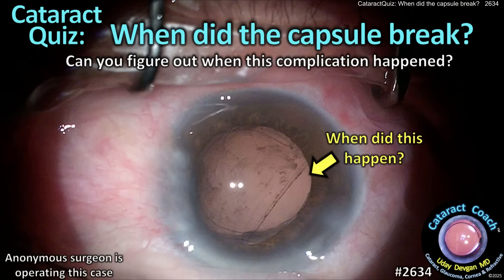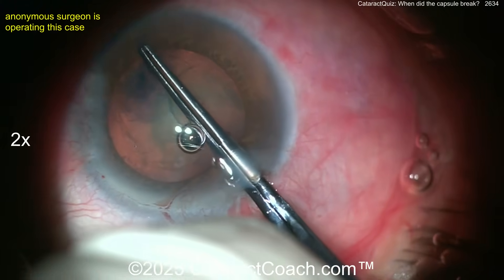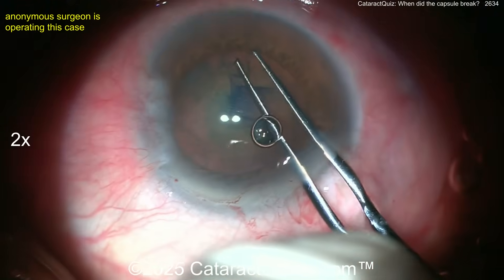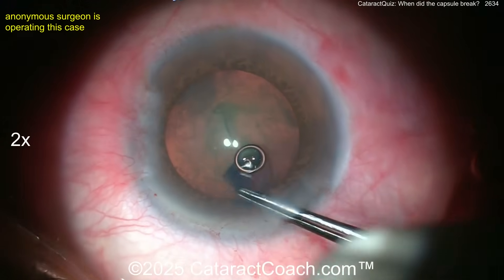CataractCoach.com cataract quiz: when did the capsule break? Can you figure out when the complication happened? Here we have an experienced surgeon operating — a good capsulorrhexis is done and the rest of the case seemed pretty normal. Everything looked routine. This part of the video is at two times normal speed.